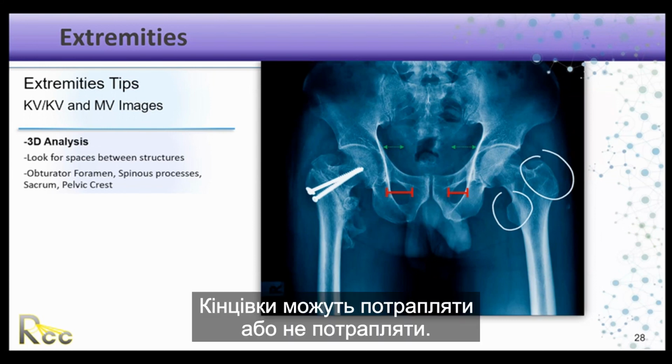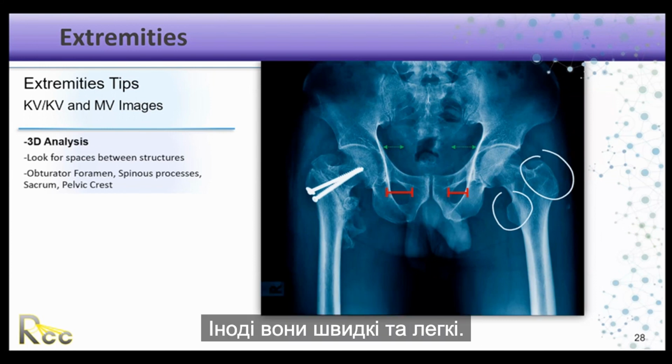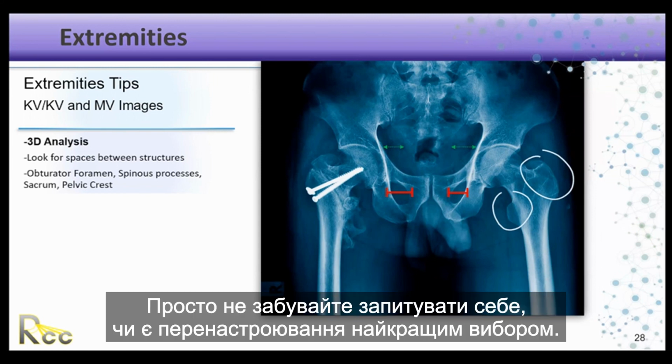So extremities can be hit or miss. Sometimes they're quick and easy. Sometimes they're difficult to set up. Just remember to ask yourself if readjusting is the best choice.